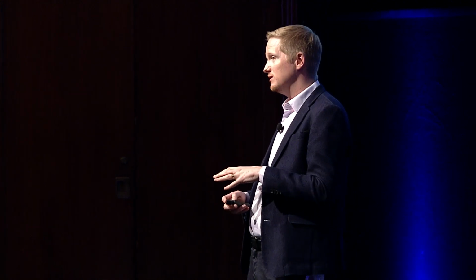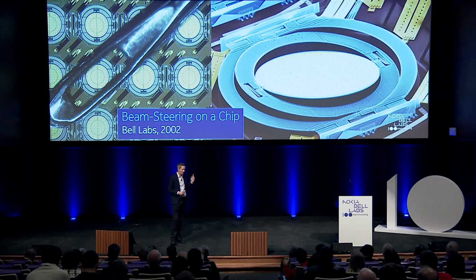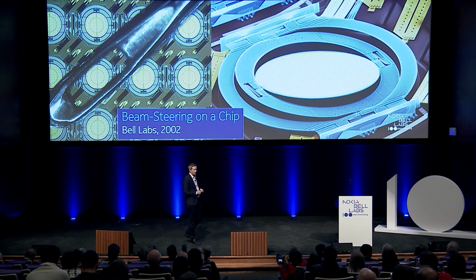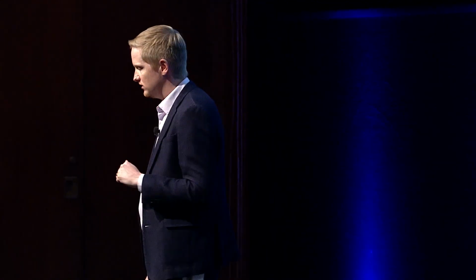And not only can we do the DSP part, we can actually make all of those pieces very small for very low cost, and we can make it very scalable. All right, so we've actually been doing this for decades. This is an example of an optical scanning mirror. It was developed about 2 decades ago to do optical cross connects. So I have a bunch of fibers coming in, and I have some mirrors here, and I can actually reroute the light from any fiber to any fiber. So we can do this. We can scan light very easily for very cheap, make it very low cost and size.